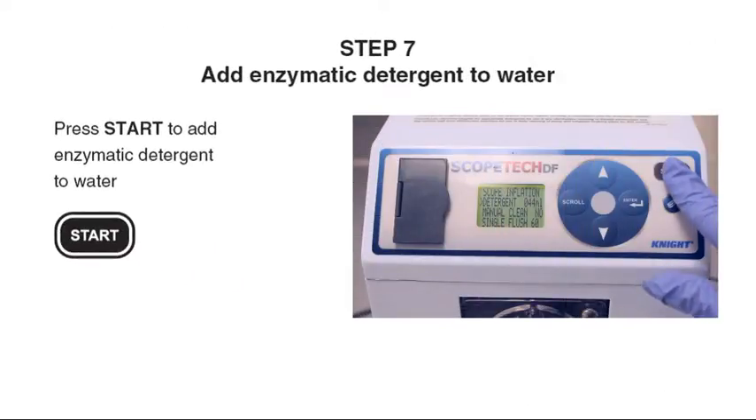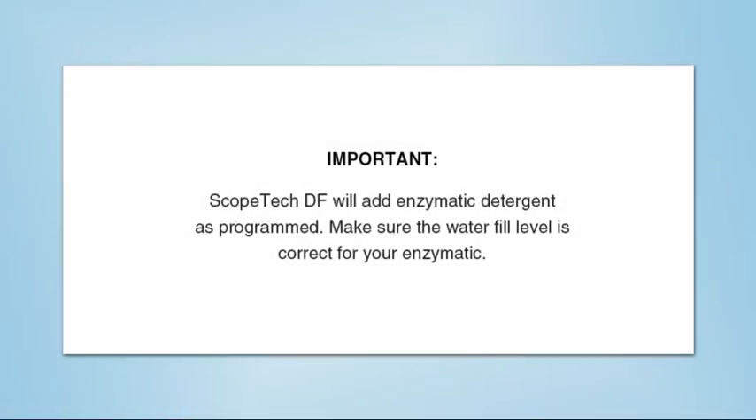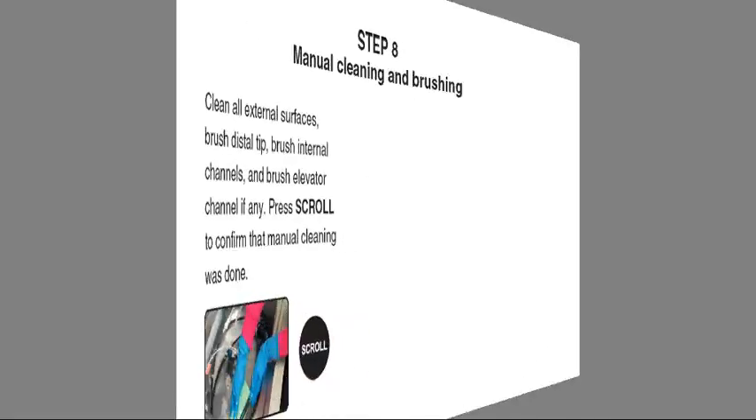Step 7: Press Start to add enzymatic detergent to the water. The Scopetech DF will add enzymatic detergent as programmed. Make sure the water fill level is correct for your enzymatic solution.